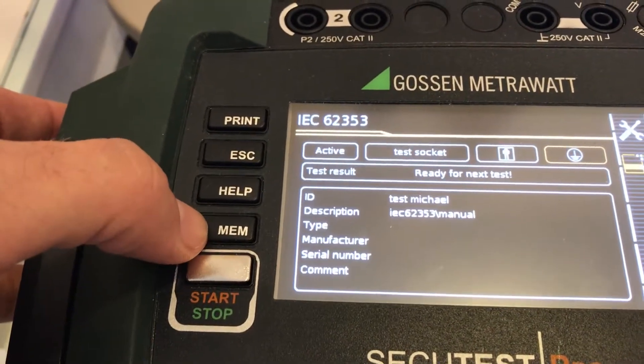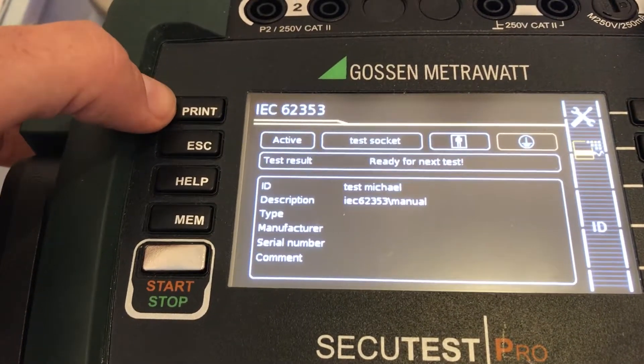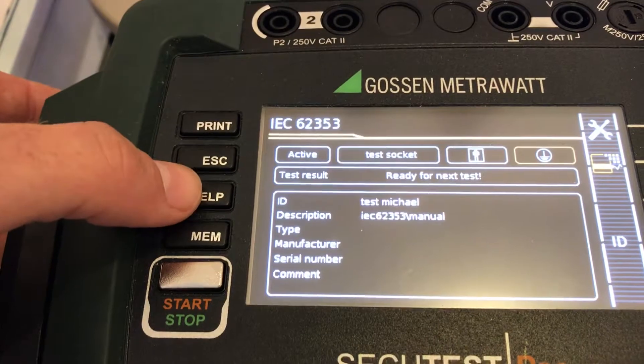We're looking at the hotkeys on the side. We have a printing function — we can use a USB printer which we can plug in on that side. There's also the escape button to move forward and backward, and then we have the help button.